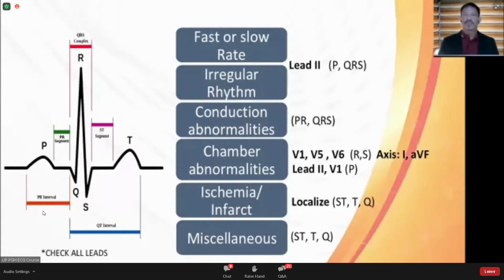These abnormalities will be discussed in detail in the succeeding lectures, and your questions will be answered during those sessions as well. To be more proficient, it will take a bit of effort requiring understanding of basic mechanisms and some memorization and pattern recognition. But I guarantee you it will be worthwhile. Practice reading ECGs. The more you see, the more you will remember. Sometimes it's easy, sometimes it's not, but that's fine.